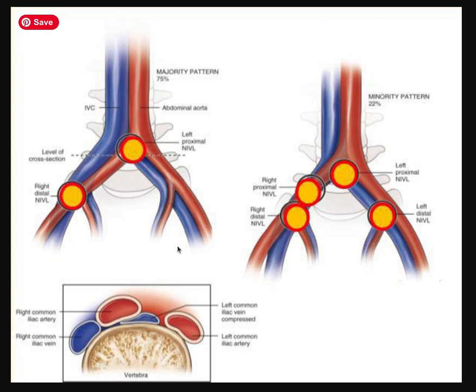Before we get to the CT scans, this view we're looking at is called a coronal view, similar to one of the CT views. This view down here is a cross-sectional or axial view. The axial view shows more clearly this compression happening between the artery and the vertebra of the left common iliac vein — you can see it gets flattened like a pancake, just after the IVC splits.